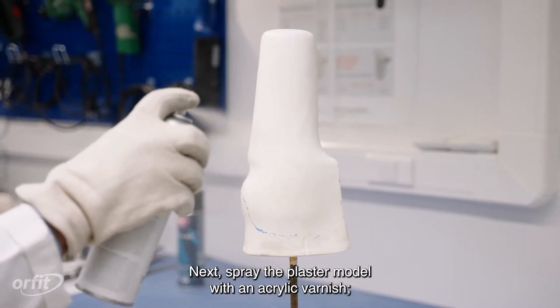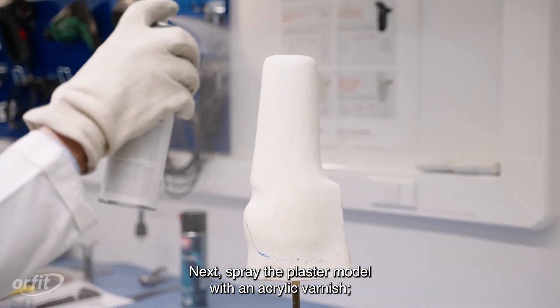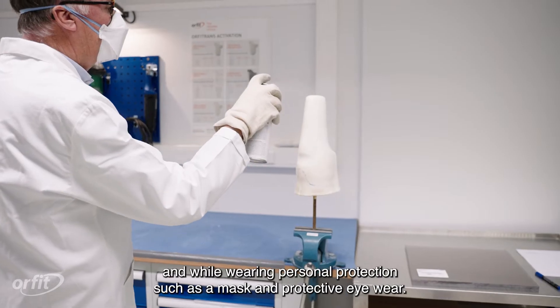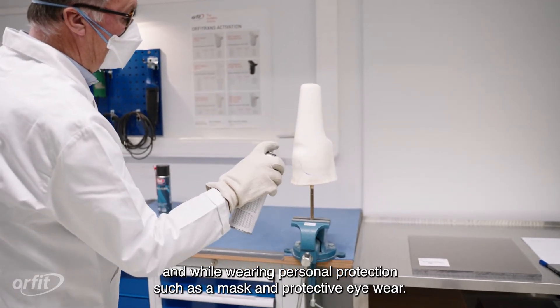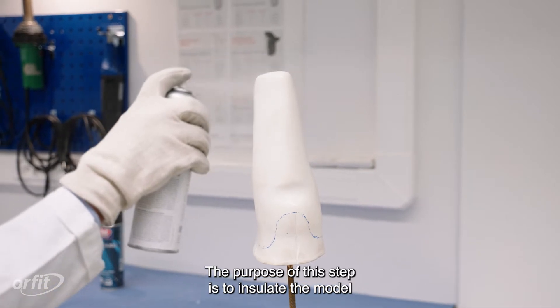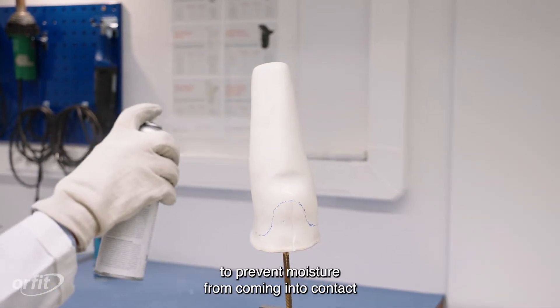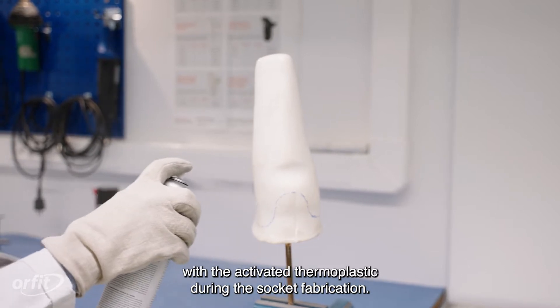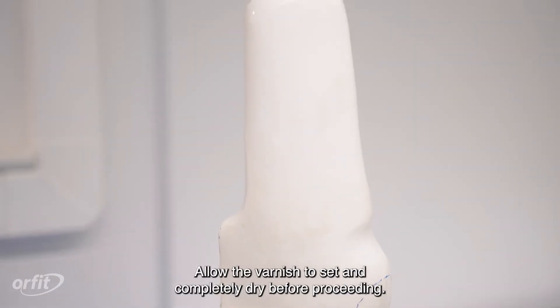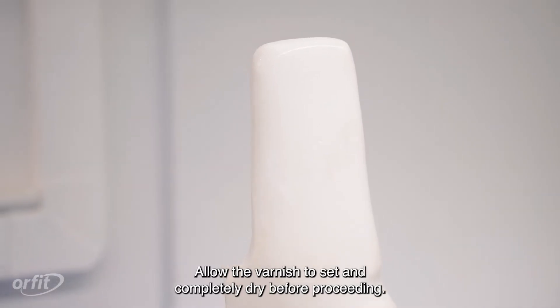Next, spray the plaster model with an acrylic varnish. Do this below an air extractor and while wearing personal protection such as a mask and protective eyewear. The purpose of this step is to insulate the model to prevent moisture from coming into contact with the activated thermoplastic during the socket fabrication. Allow the varnish to set and completely dry before proceeding.